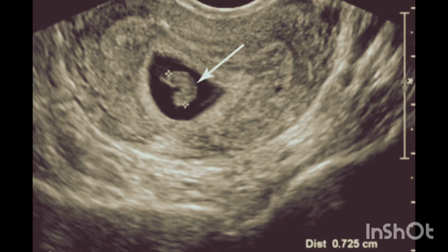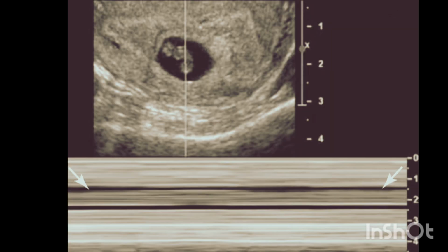Let's see a few images of failed pregnancy. In this image, you can see an embryo with CRL measuring 7.2 millimeters. When M mode was applied to the same embryo to check for a heartbeat, there was no cardiac activity seen. So this is a definitive failed pregnancy.